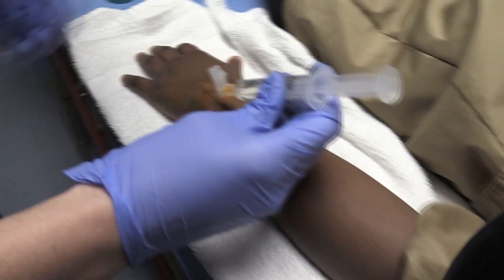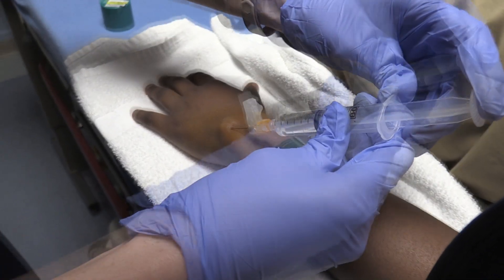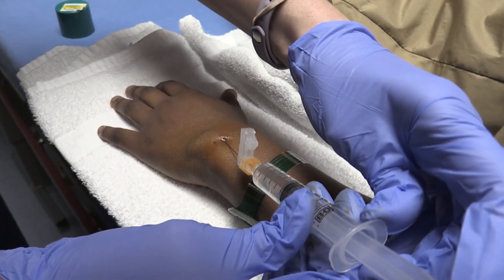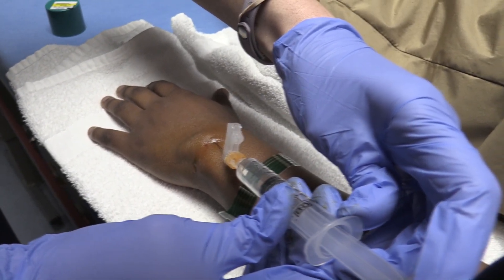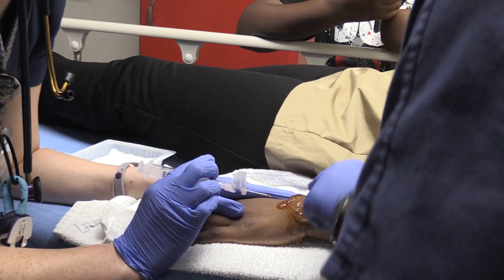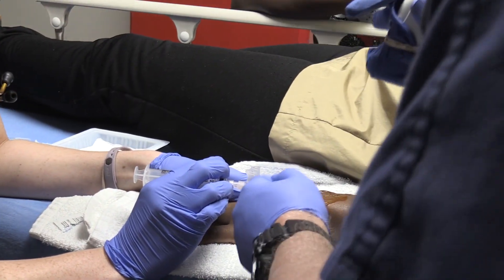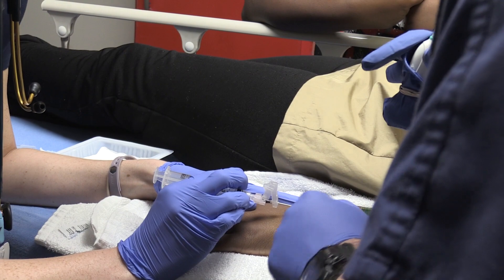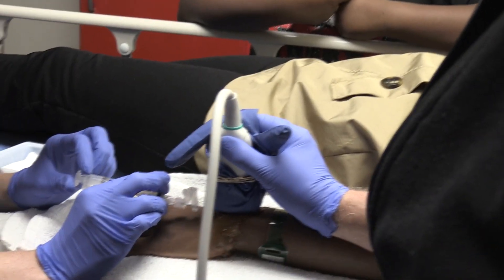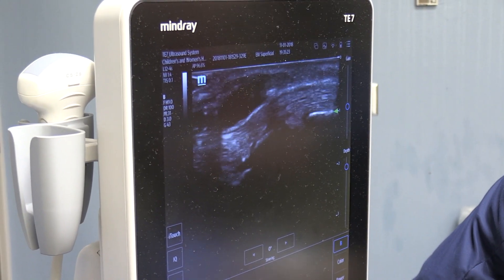Small pinch. You're doing great. We're going along both sides of it here, so you're just going to go between those two. Make your first pass — before I put the ultrasound down — just go put your needle in. Okay, good. Now watch — your needle's in there. Go ahead and aspirate fluid out.